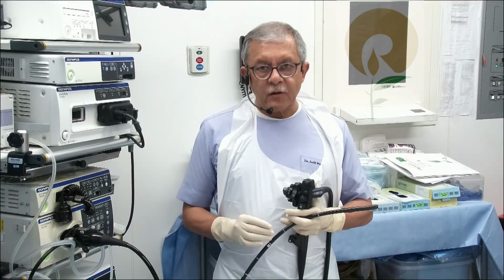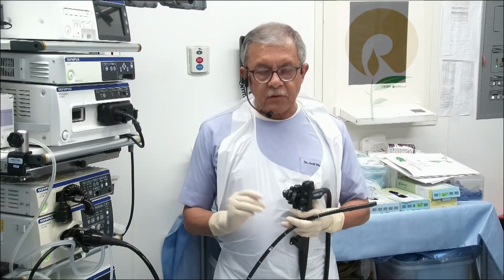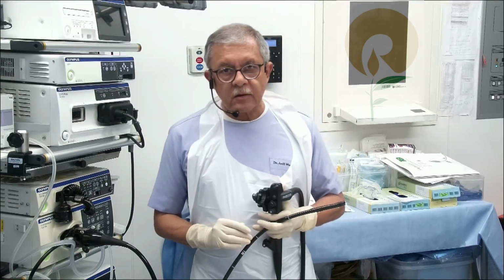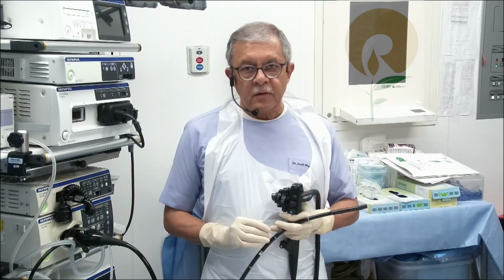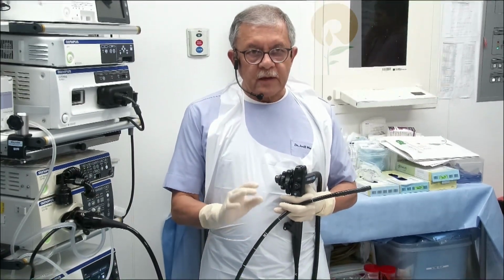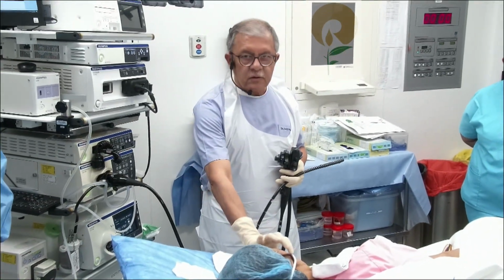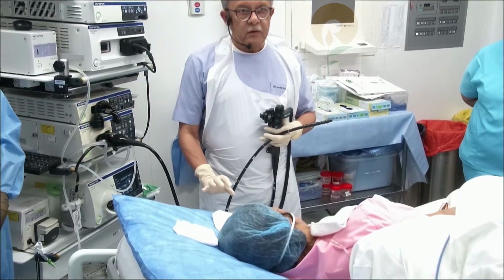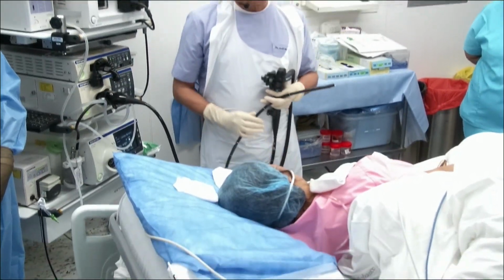So for upper GI endoscopy, we call the patient on an empty stomach for at least 6 hours, and then we usually perform the procedure under total intravenous anesthesia called TIVA. So the patient is made to lie down on the bed in the left lateral position, and then we attach a mouthpiece inside the mouth so that the patient does not bite the endoscope. This mouthpiece is fixed to the neck with this elastic band.